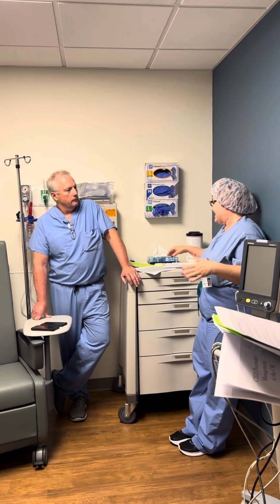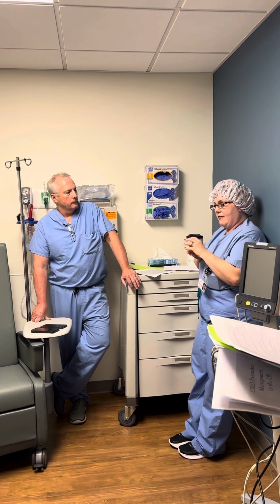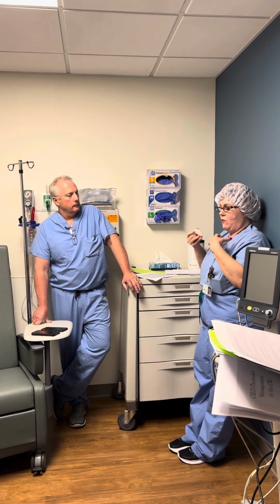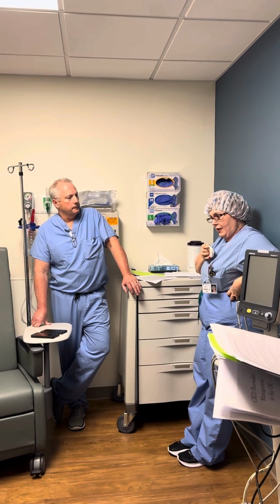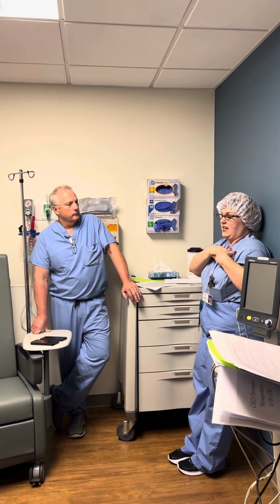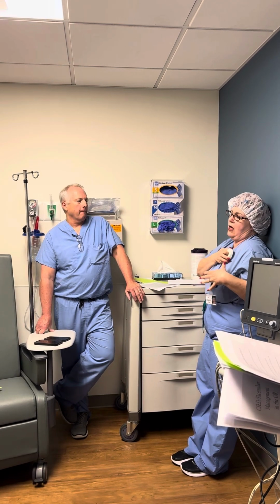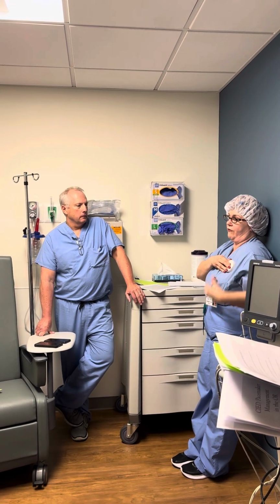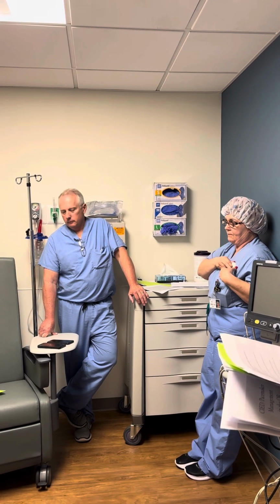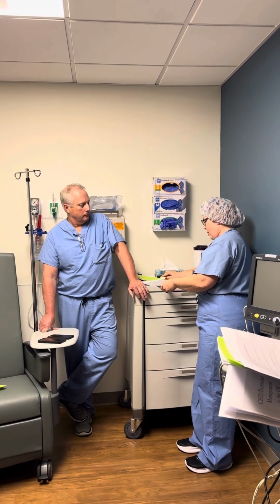We may place the magnet over the device, but again, that's going to be more of an anesthesia call. Most of the time they're up here, but they can be on the side. You want to make sure it's securely taped over the device and doesn't move. I have seen it where I've come into a room, at other places, where supposedly it was over the device, but the tape was so loose it had shifted up and it wasn't. So it's important to make sure that tape, if it's on there, is secure.